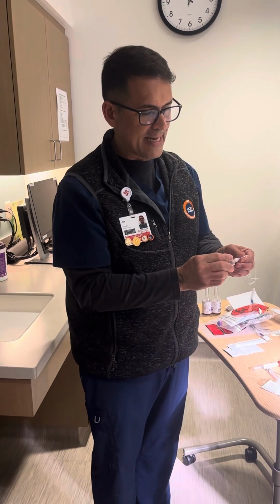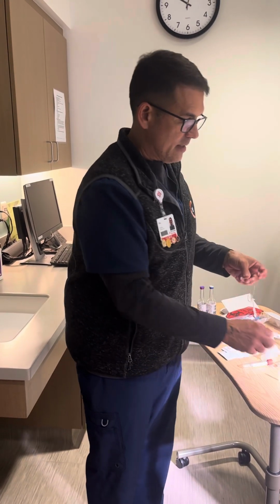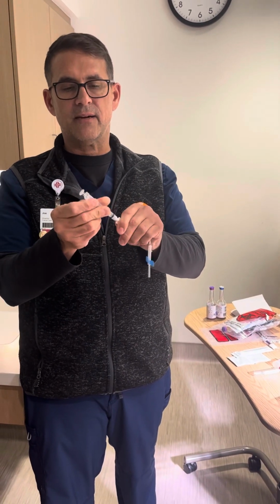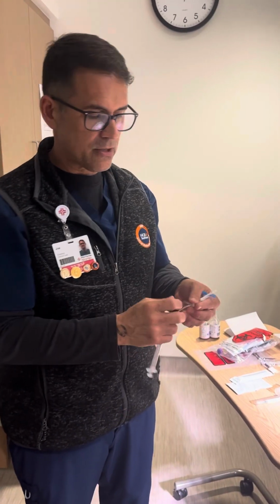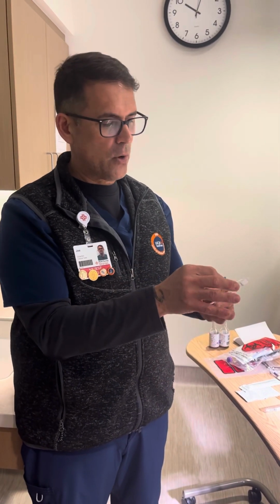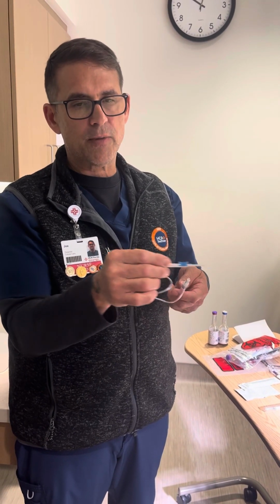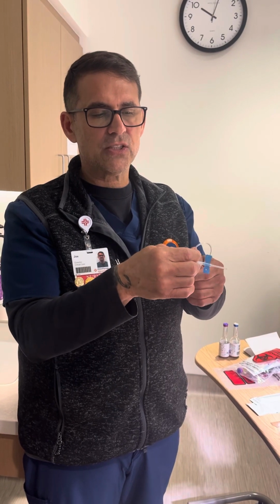Now again, for the pediatric blood cultures, if you're just drawing 1 ml, what we recommend is that you sterilely, without this touching anything else, hook up your syringe right there. Make sure that this syringe didn't touch anything, because if it was out of the package, it's done. And then you're going to scrub and, obviously, poke the kid, draw your blood, and after you've drawn your blood and you remove this needle, don't aspirate the last bit of blood, because that's gone back to the skin and you might get a contaminant in there. So just take this off and use your transfer device and put it in your blood culture bottle.